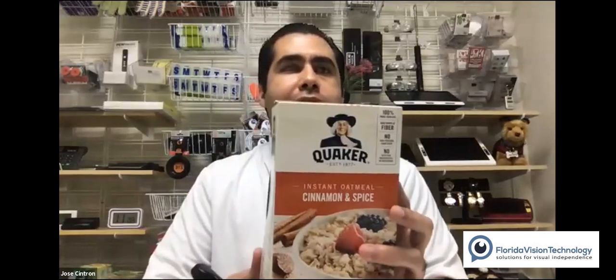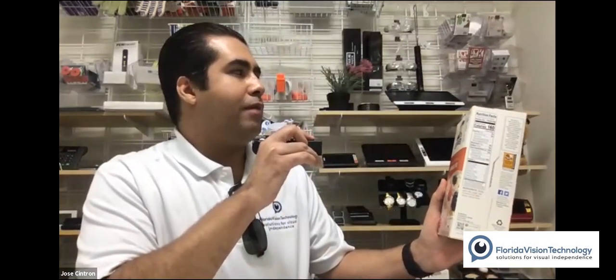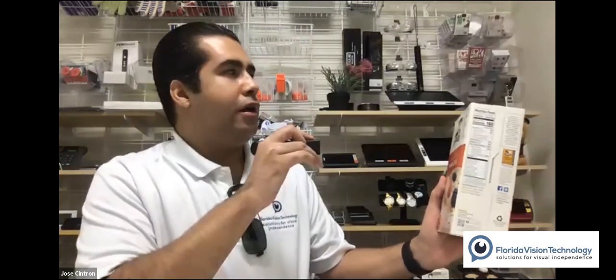So I have 3 different ways we're going to use the OrCam today to replicate different scenarios that you might do throughout your day, okay? So the first thing I like to use the OrCam for myself is when I'm shopping, right? I'm totally blind, and due to that, I cannot see print, but I still need to know what's on products. So here I have with me a box. And maybe I want to know what's on the box, okay? So I'm going to hold my OrCam about 8 to 12 inches away from the box. I'm going to press that trigger button real quick.